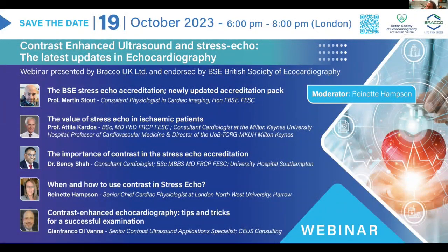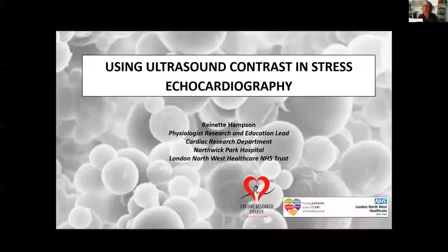I've been asked to talk about when and how to use contrast in stress echo. Now, the when is very easy. The BSE guidelines on the use of contrast in stress echo, which will hopefully be published in the next couple of weeks, will state that if one segment is not seen well, before or after deep inspiration, you should administer contrast. The reason for this is that flow-limiting coronary artery disease can occur in one artery, and ischemia can manifest itself in one segment.